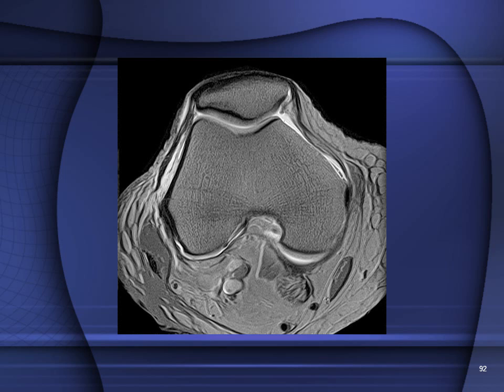Well, using the magic of PowerPoint, I can bisect this knee. I bisect the patella and the distal femur using this yellow line. And then I draw perpendicular lines extending from the yellow line laterally to the end of the condyle on either side. And then I compare the length of these perpendicular lines. Okay? And it appears that the red line is longer than the green line.